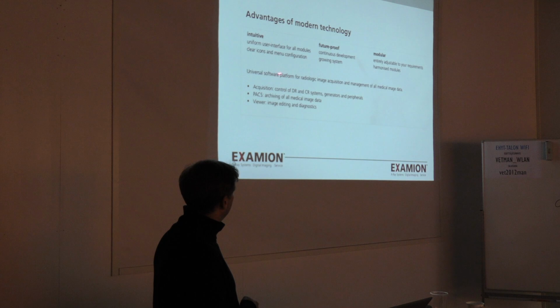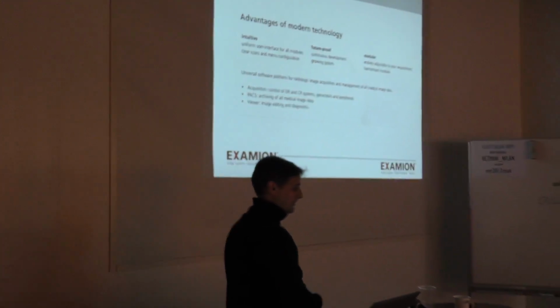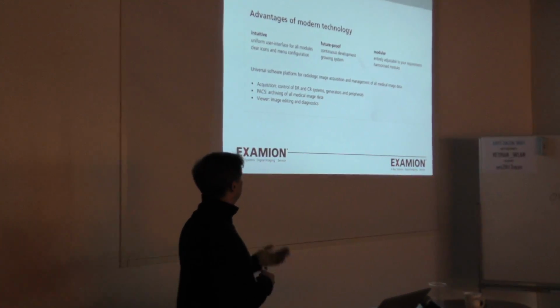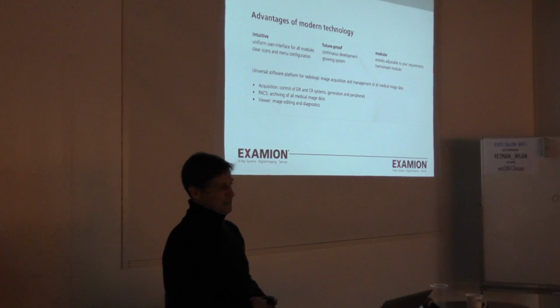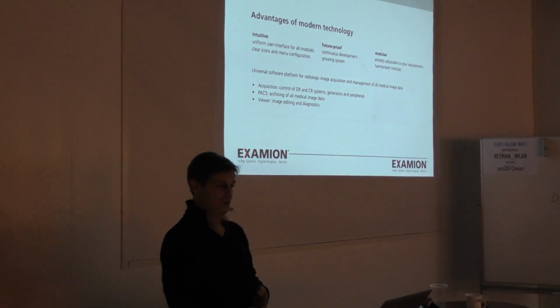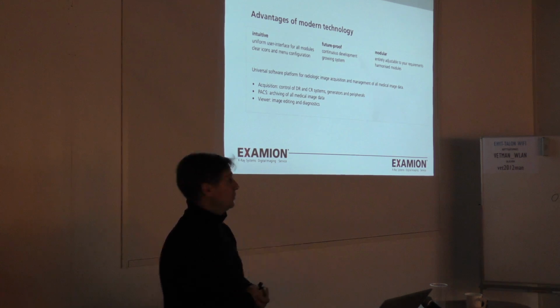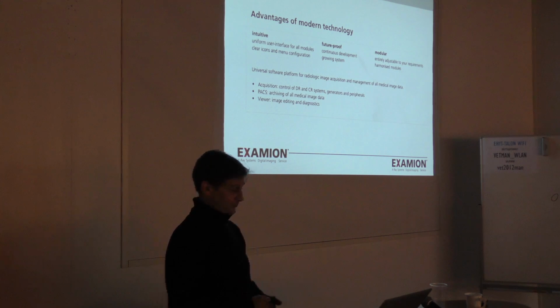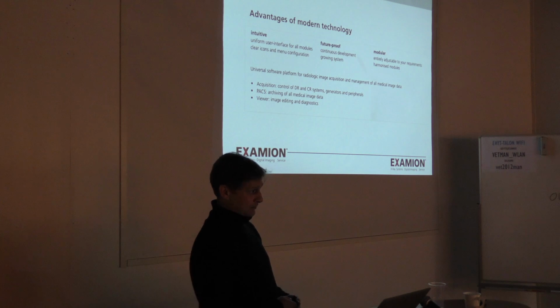An X-ray machine, I would say, the intuitiveness of the machine is important. As a veterinarian, you want to focus on the animal, not on the X-ray machine. So intuitiveness from the machine is very important. It needs to be automated in such a way that when you put the animal on and you say, I want to take this shot, everything is actually preset for you. So with a simple press of the button, you will have your picture, and probably also in the way you like it. It has to be future-proof, which is also an advantage, and more machines which are modern now are built in that way, so they are modular, meaning that certain components can be adapted.